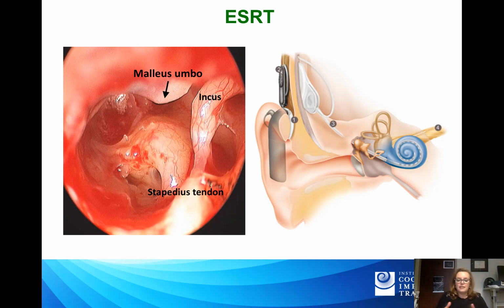And what that does is it allows us to focus on the stiffness dominated system. And what that shows is if there's any changes to the stiffness of that system, you're likely going to see an effect with that probe tone at that low frequency. So think about it with a cochlear implant recipient.